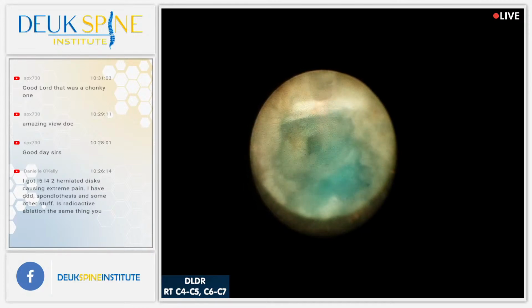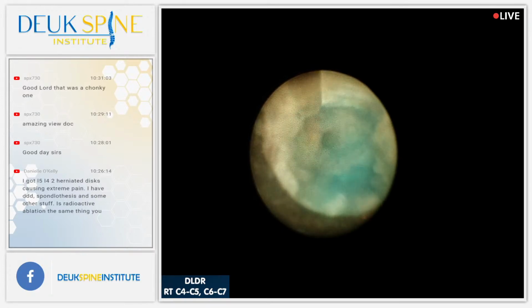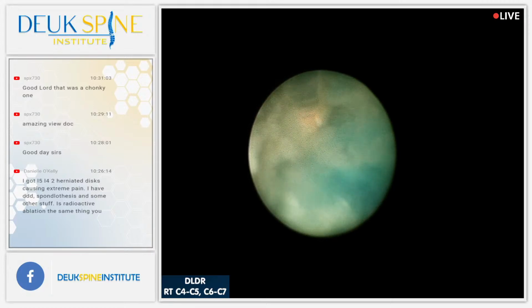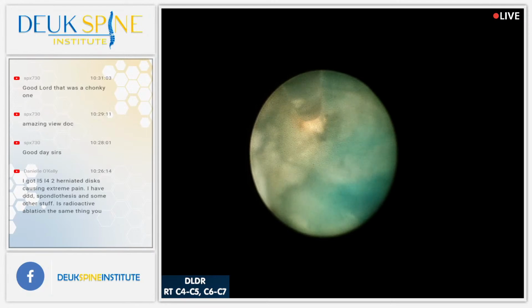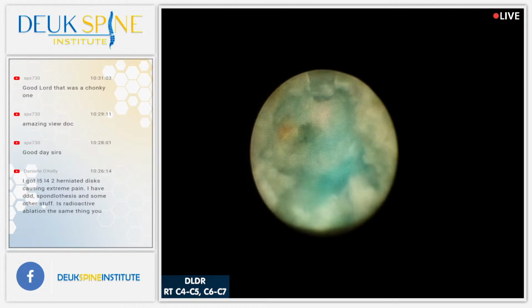And there's a reason for that. They make a lot of money doing those procedures that don't work, and it keeps the patients coming back for more. So it makes great business sense for them, but it's not good for you, the patient, because you want to be fixed. All right, so I have gotten about 90% of that herniation out.